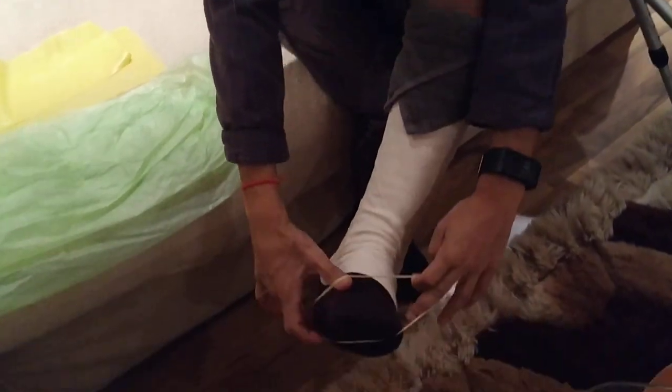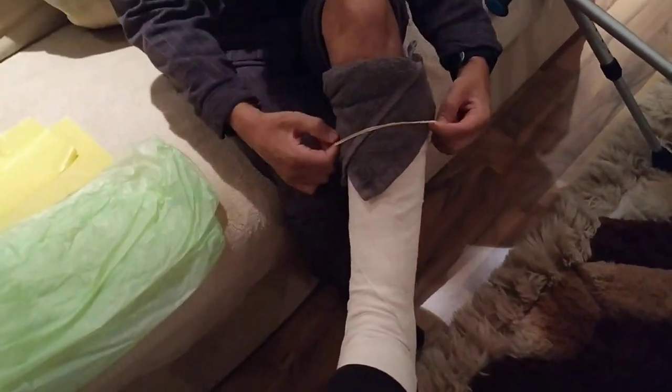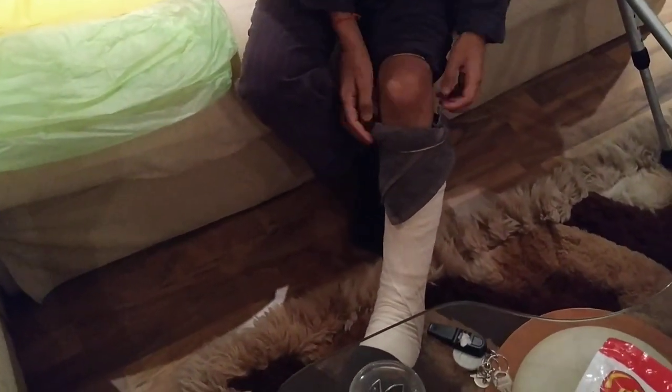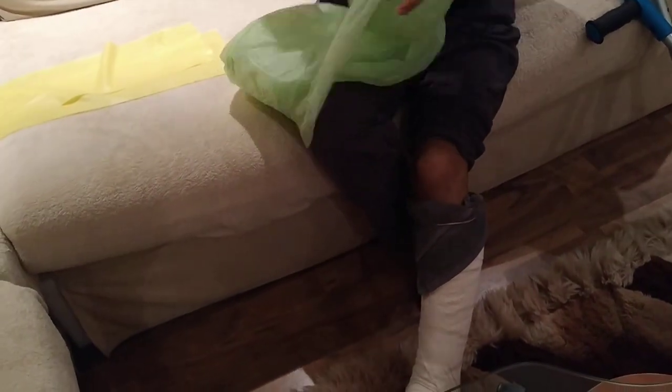Then you take a couple of rubber bands — in fact, take all of them — push them over your cast right to the top. Two of them you will use on top of that to keep this in place. Just check that it's fully sealed.